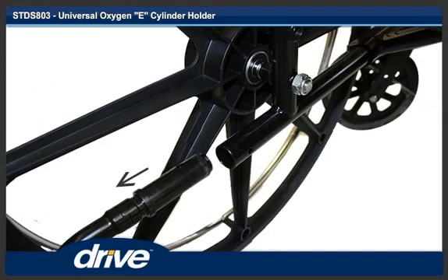Step 2. Remove the left anti-tipper or tipping sleeve if present.